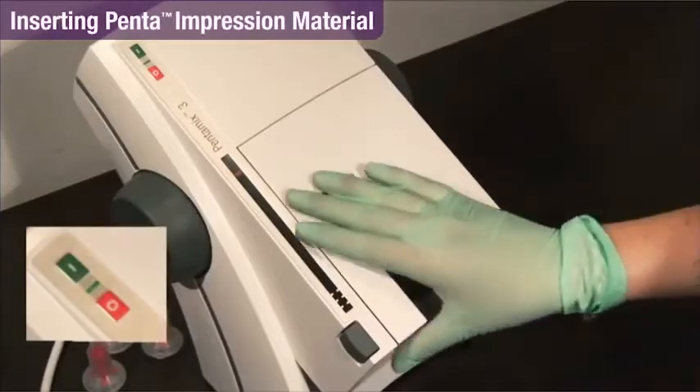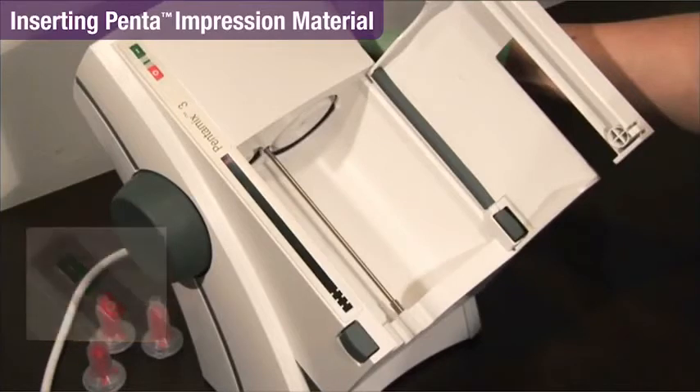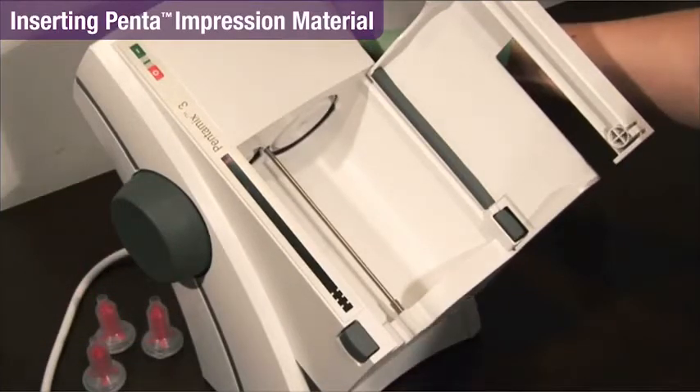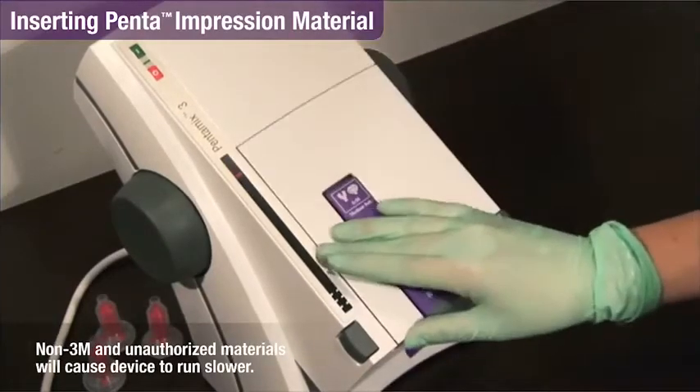Outside the PentaMix 3 Mixer, the locking lever serves as a convenient handle. The mixing unit gathers specific information about the material you're mixing via radio frequency, and automatically sets the proper mixing parameters.